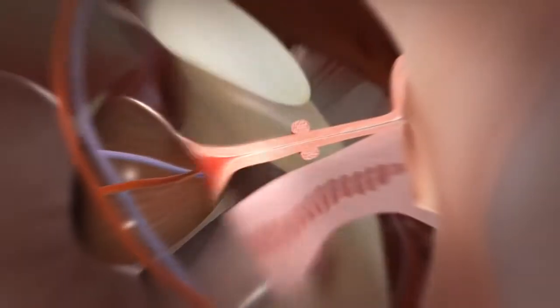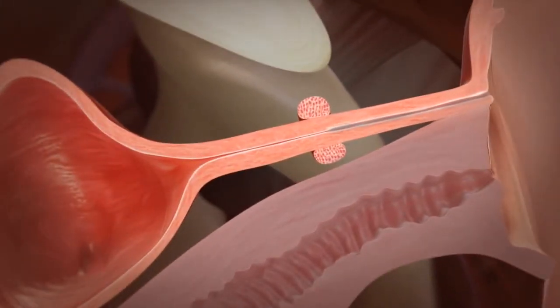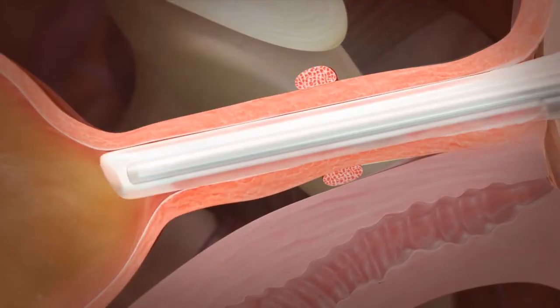Local anaesthetic gel is applied inside the urethra, and if required, an additional injection of lidocaine, 5 to 10 milliliters, is placed bilaterally to the urethra at the 3 and 9 o'clock positions, 5 to 10 minutes prior to treatment. The Bulkamid system is introduced into the urethra and the bladder inspected.